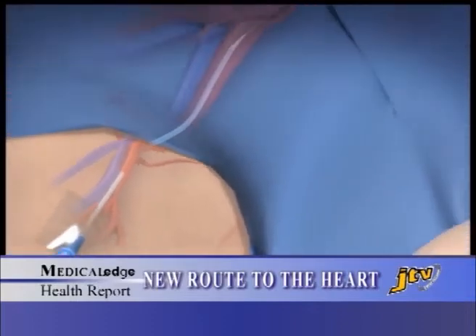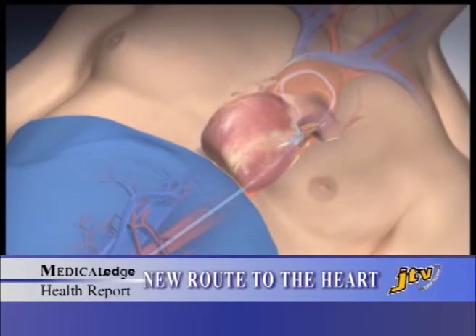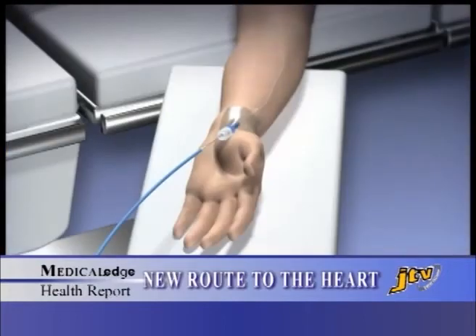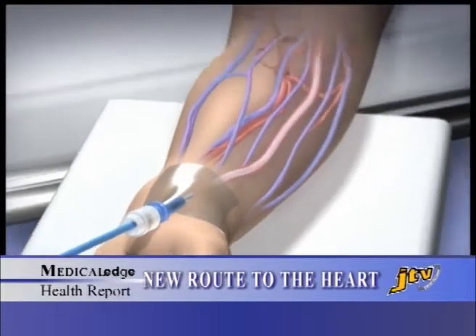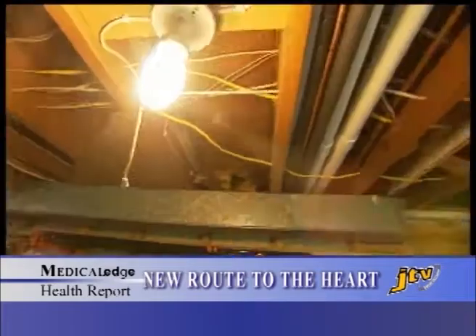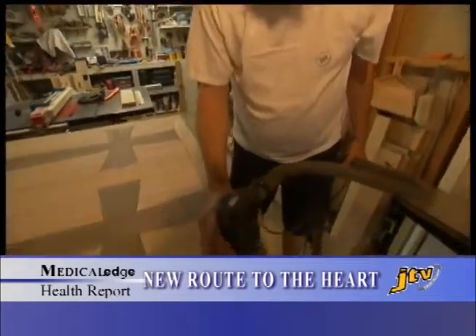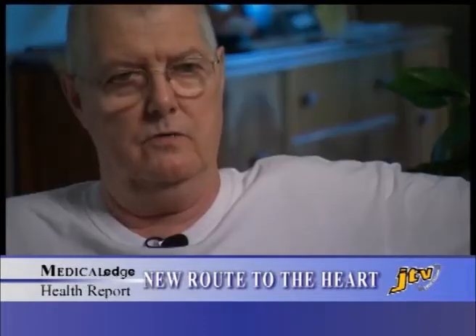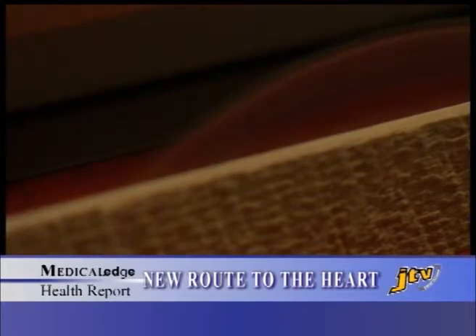For the traditional method, doctors place the catheter into the femoral artery and run it up to the heart. For the other method, doctors start at the radial artery in the wrist and thread the catheter to the heart. Same access to arteries, but fewer risks. Greg says if he ever has to have another stent, he's going to opt for the wrist procedure. "I know the difference."